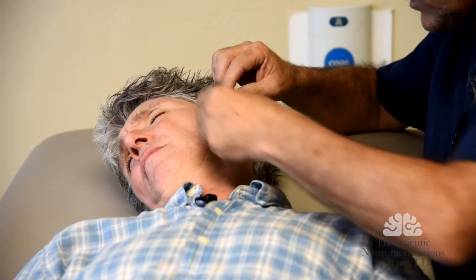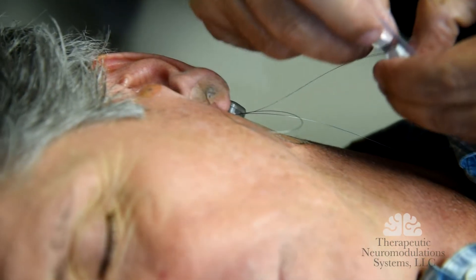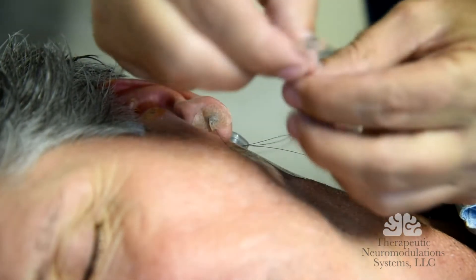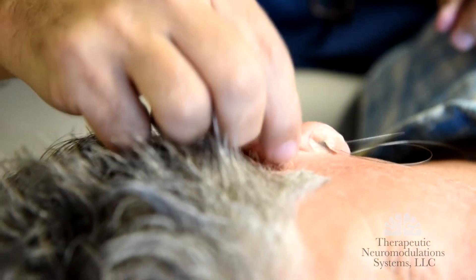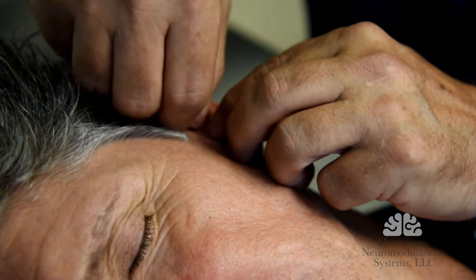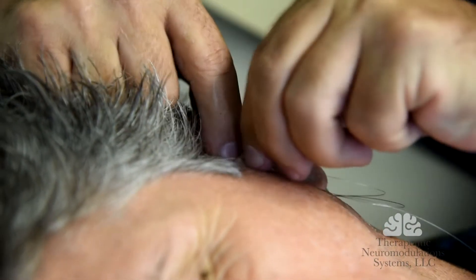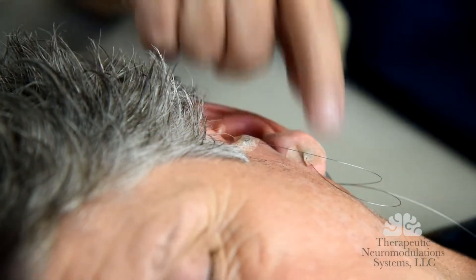So we're going to set the next needle in place. We're going to get the next needle. Take this needle out, and we're going to go around. Got it. All right, we're going to take this one, install, and update — all the way around. That's installed. So that one's installed. We have one more to install.